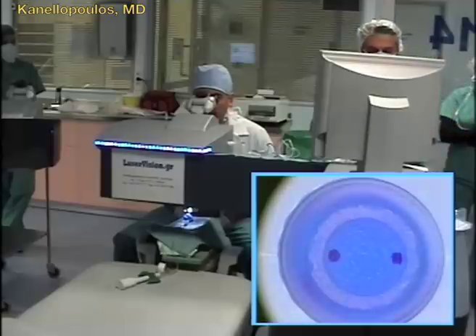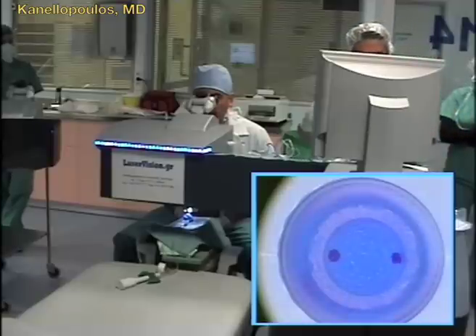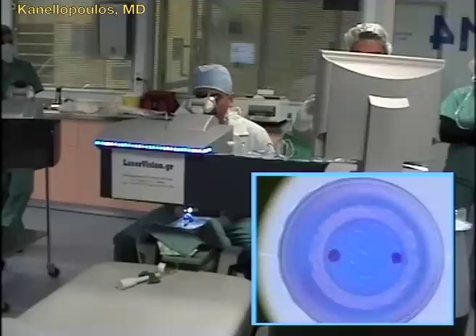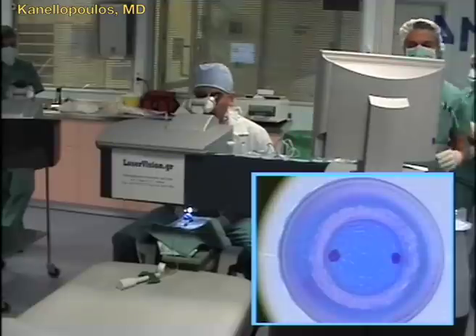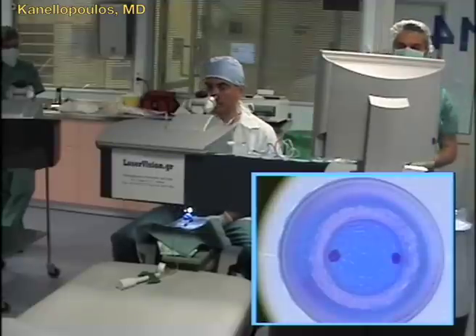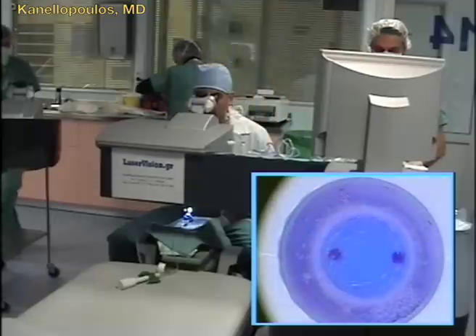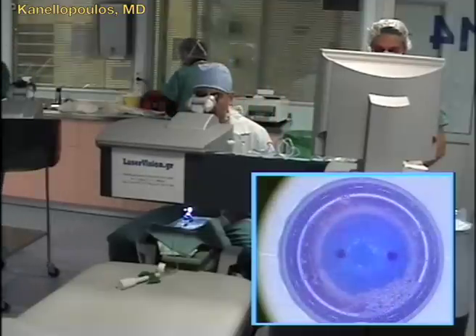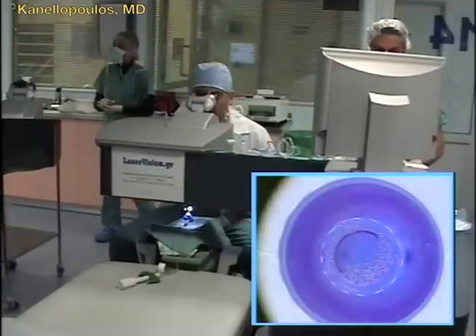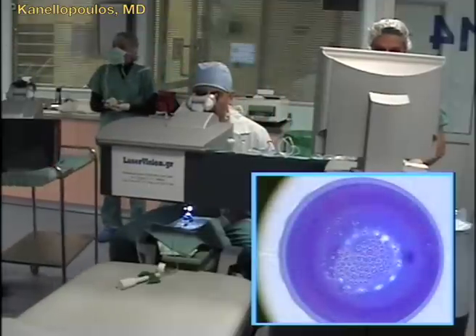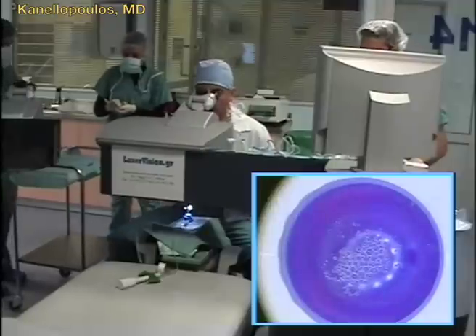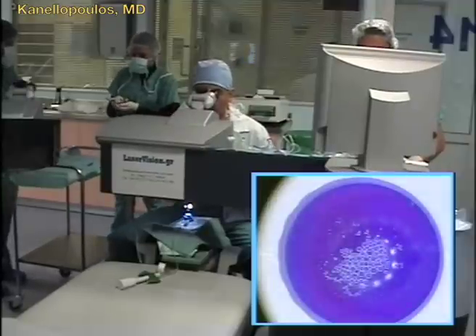This is a zigzag pattern, which means this side trefination has a step around the middle — around 350 to 450 microns — a tooth that goes out to 8.5 millimeters in order to create more adherence when the graft will be sutured in place. So, we're done with the patient interface.